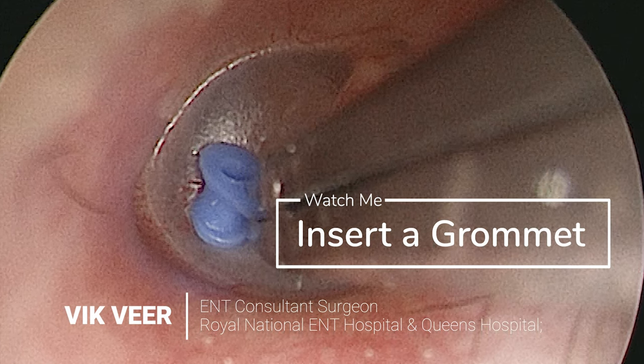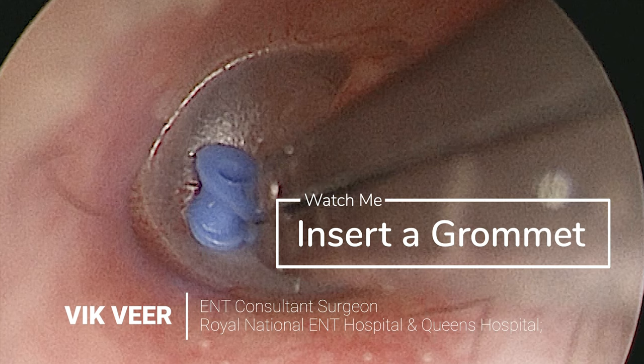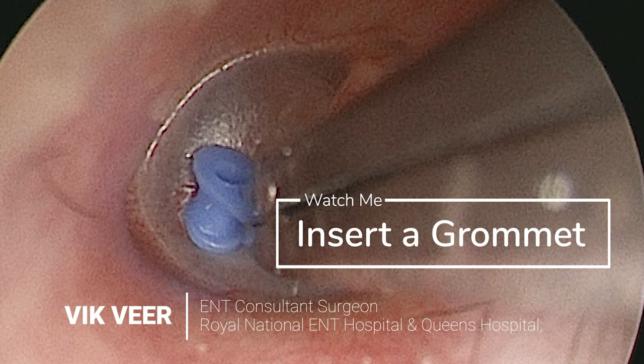To make it vaguely interesting for the junior doctors who may be watching this, your challenge is to pick out the three technical errors that I made during this operation.